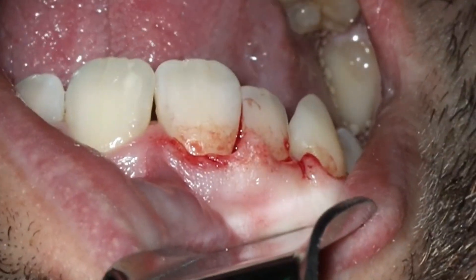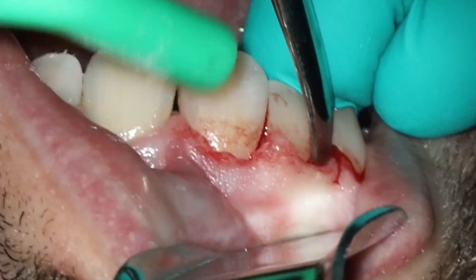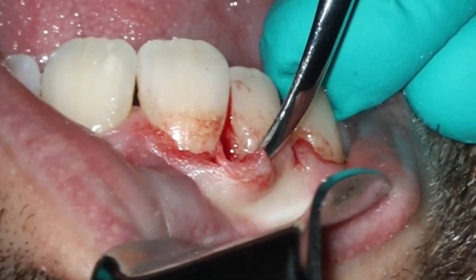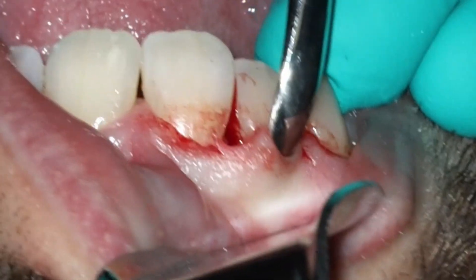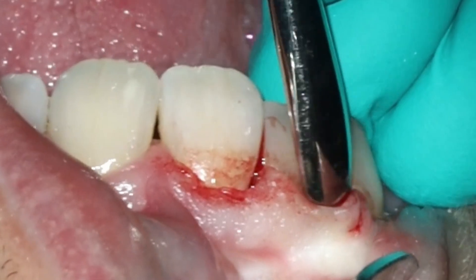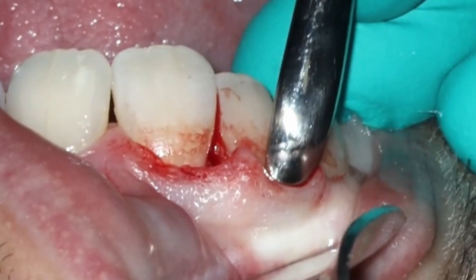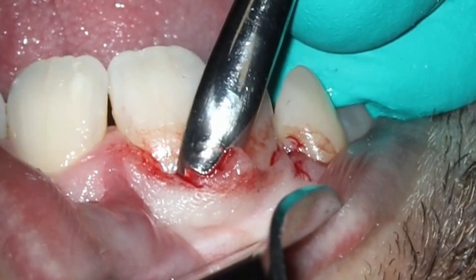I have a nice kit for apicoectomies and then I have a quick-and-dirty kit for extractions — this is the quick-and-dirty kit. I think I'm going to be buying a nicer elevator, because when you zoom in and see the size of that number nine, that thing's huge. What we're doing now — you can definitely see right there the exposed area where the resorptive defect is. Just taking my time here to gently tease back these papillae, because that's what's going to hold this mostly in place. I want to keep these as intact as possible. You can see a tiny little tear between six and seven, so we'll fix that when we go back to do the sutures.